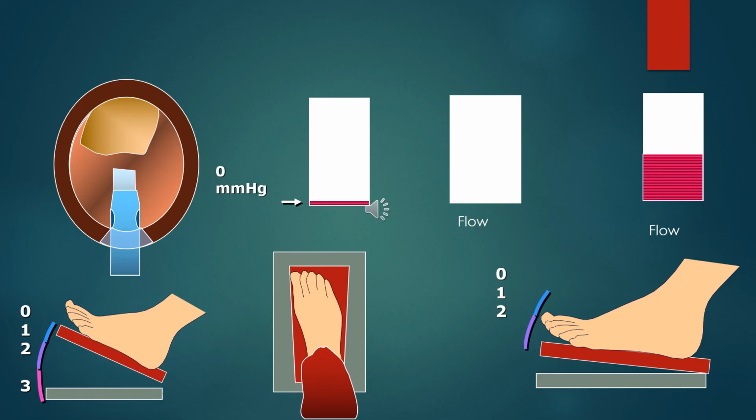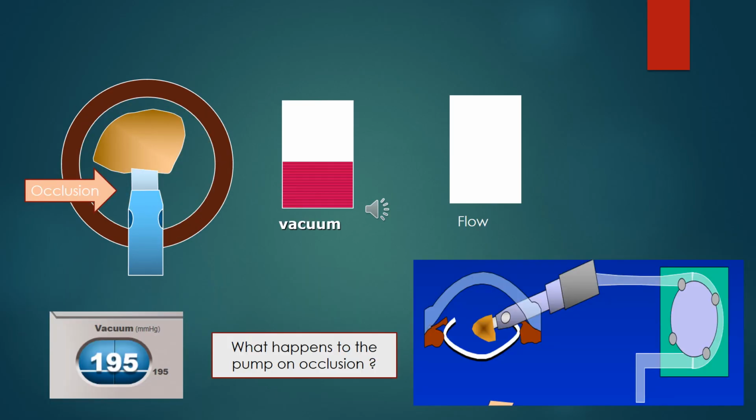As you break it into pieces, the vacuum drops, the pump starts rotating again. As the pump starts rotating, the nucleus pieces that have been broken are got rid of, sucked inside the phaco tip and thrown into the cassette and into the drainage bag. So that's basically the science behind phaco machines, the peristaltic phaco machine.